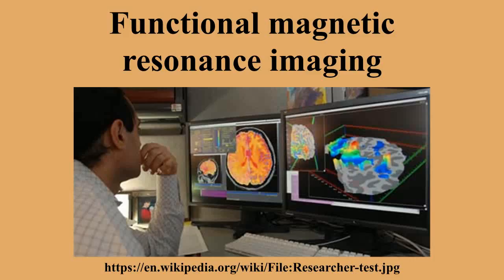This strong assumption was first studied in 1996 by Boynton and colleagues, who checked the effects on the primary visual cortex of patterns flickering 8 times a second and presented for 3 to 24 seconds. The results showed that when visual contrast of the image was increased, the HDR shape stayed the same but its amplitude increased proportionally. With some exceptions, responses to longer stimuli could also be inferred by adding together the responses for multiple shorter stimuli summing to the same longer duration.